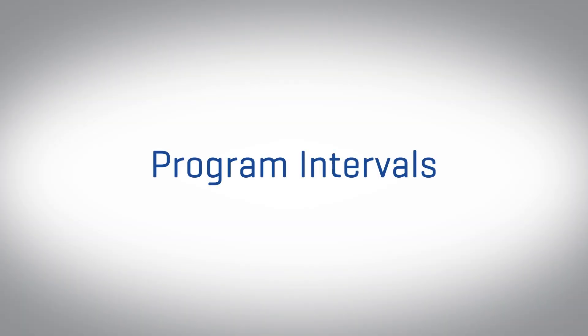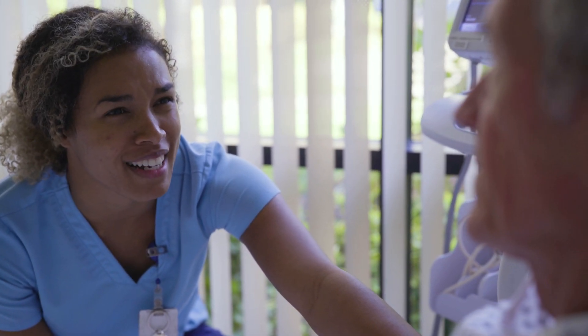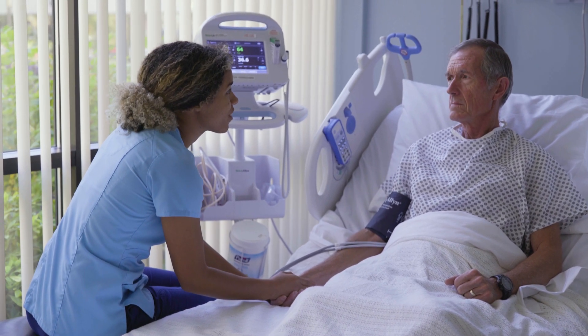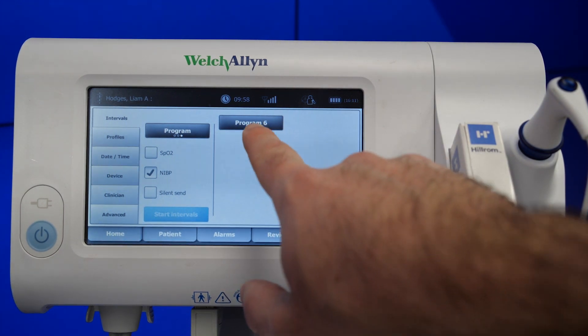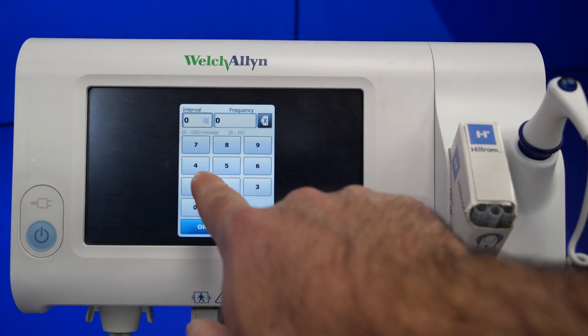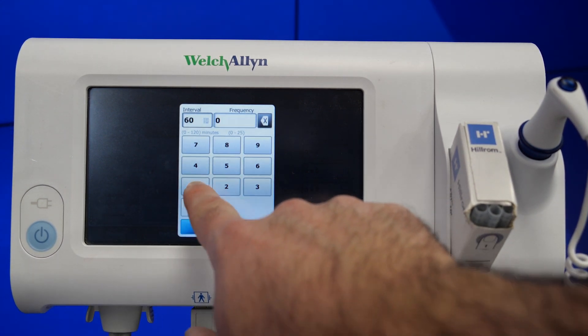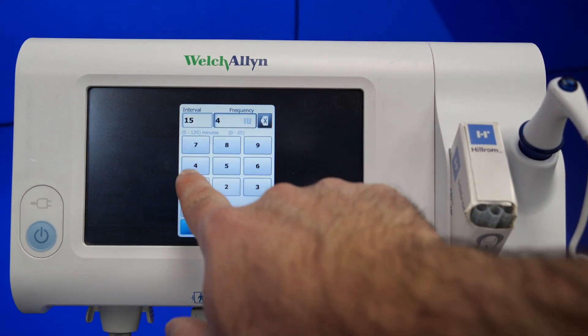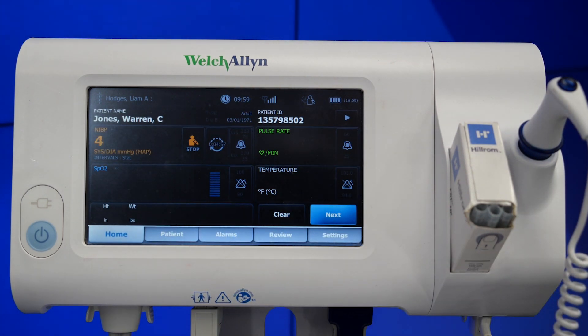The second type of interval mode available is program intervals. This allows you to configure the monitor to take automatic NIBP measurements at variable timeframes. Preset programs do exist, but they can also be edited to meet your needs. To work with program intervals, touch the interval icon and then touch program. The selections under program will indicate the duration of each interval, for example 60 minutes, and the number of minutes between each interval cycle, for example every 15 minutes. As soon as you touch the start interval button, the monitor starts the first measurement immediately. Then after the first measurement, the interval cycle begins, and the second measurement starts at the program's selected time after the first measurement is complete.